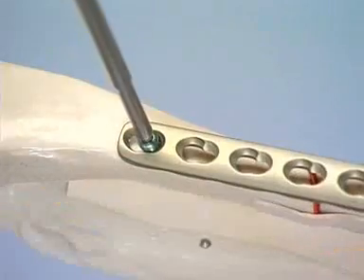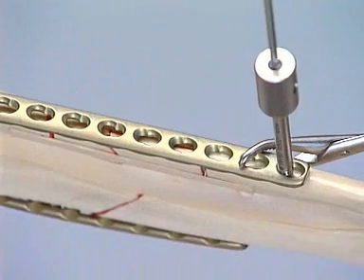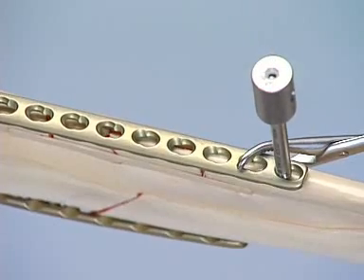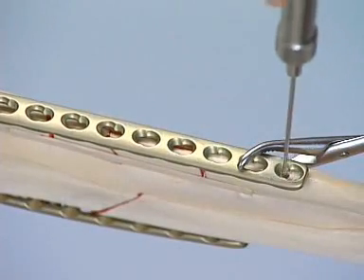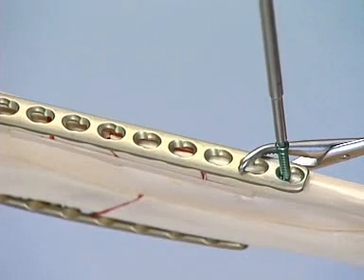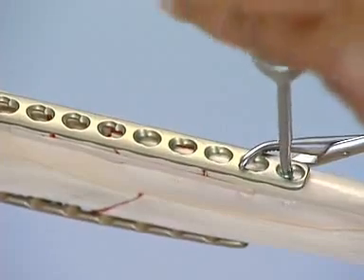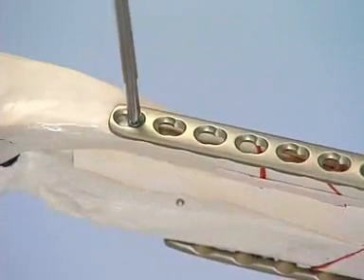At this point, if the other end of the plate is not well secured, the helicopter effect may occur. Before completely tightening the first screw, the plate is fixed to the bone using the most distal plate hole in the same manner. This screw may be fully tightened, which is signaled by a click. The first screw is then fully tightened, again until a click is heard.